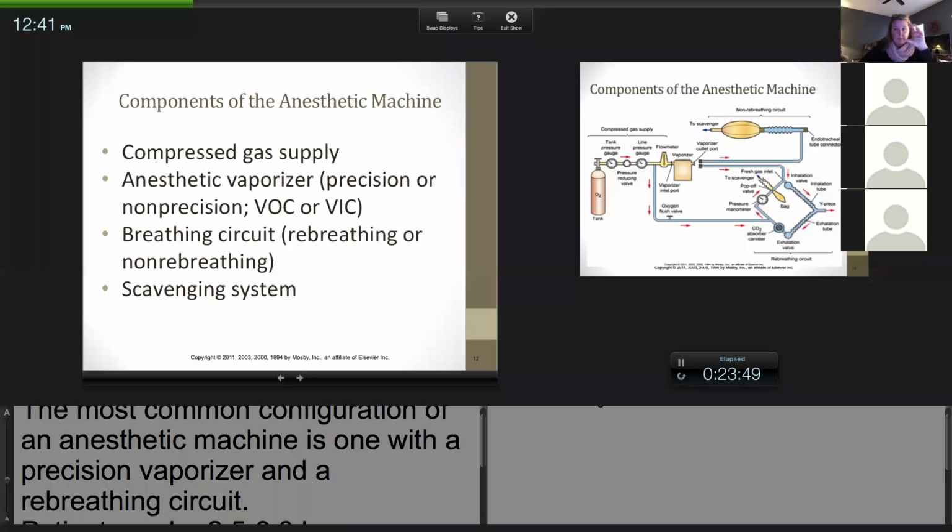So they have different colors and different pin coding systems. If you remember that, when you guys put an oxygen tank on your anesthetic machines, say you had nitrous tanks, you couldn't put a nitrous tank where the oxygen tank goes because the coding system doesn't set up, the pins won't fit, basically. So color is a safety mechanism, and then the pin system to the tank, and then the tubing is also, you know, the oxygen tube is green. So the color coding is so that we make sure everything's correct.